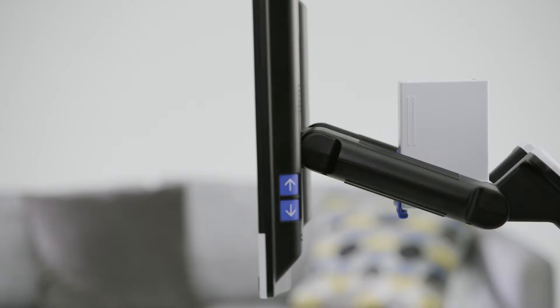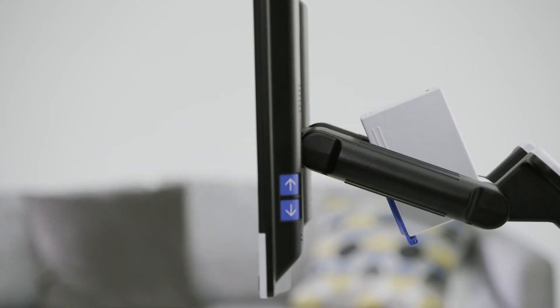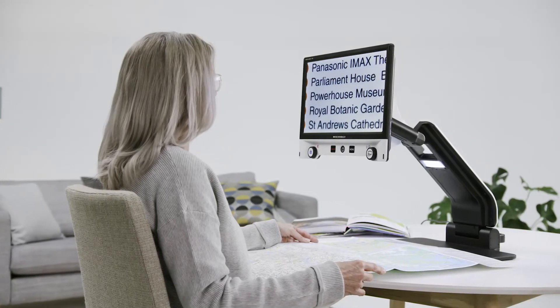The camera can be easily tilted for reading large formats. This allows you to view the upper area of the reading material.